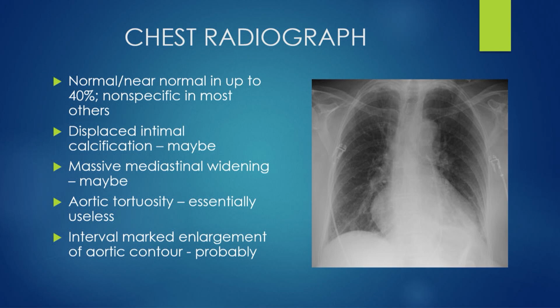The reality is very different. The chest radiograph is a largely useless technique for this diagnosis, but that's apparently not what certain people think. So it's normal to near normal in up to 40%. It's nonspecific in the rest.